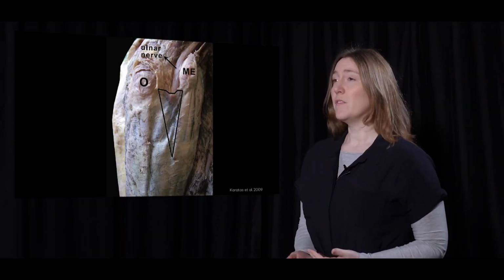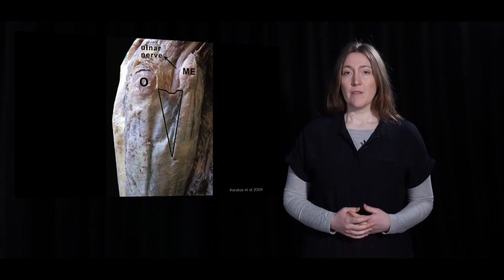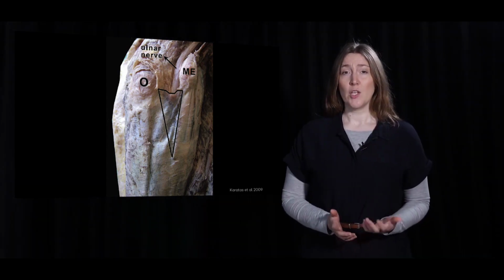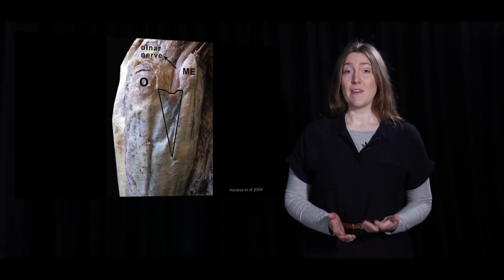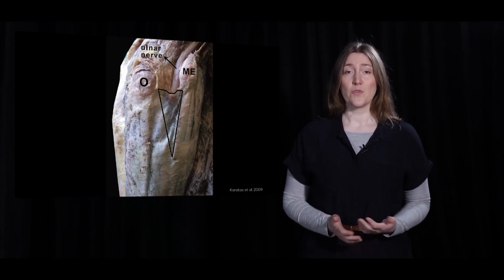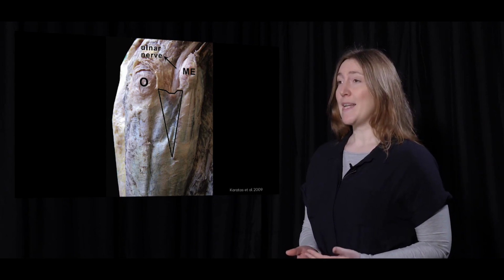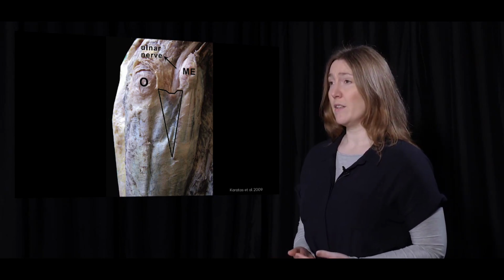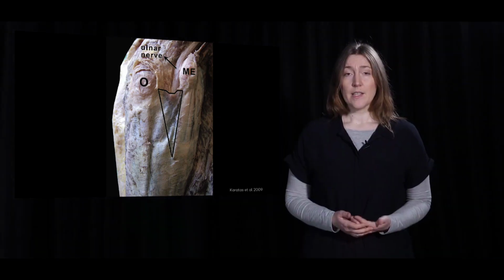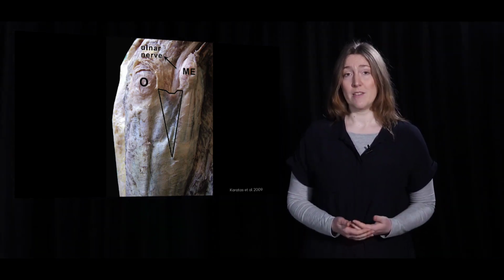If following a nerve, the echogenicity of the nerve can change. For example, the ulnar nerve in the cubital tunnel. In this cubital tunnel, the nerve is very superficial and vulnerable to trauma. At this location, the ulnar nerve is embedded in fat tissue which acts as a shock absorber to protect the ulnar nerve. The surrounding fat tissue gives the ulnar nerve a more hypoechoic appearance.